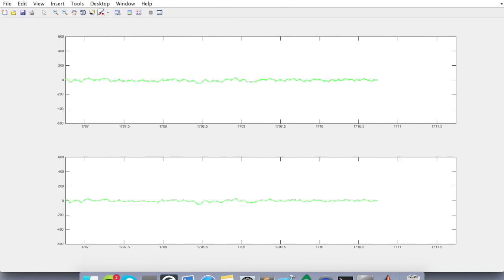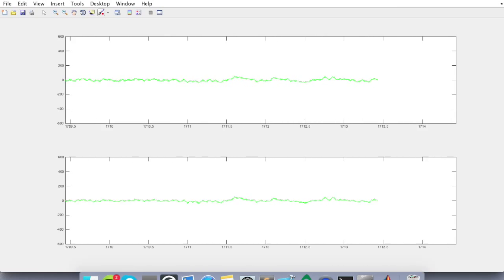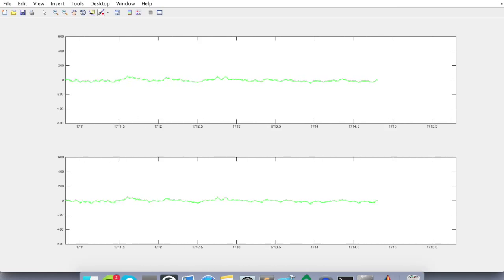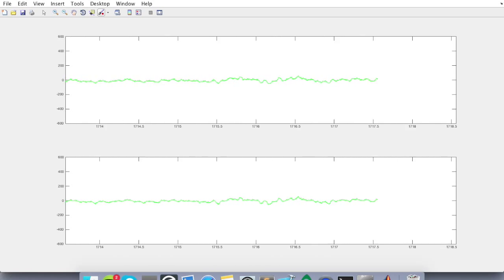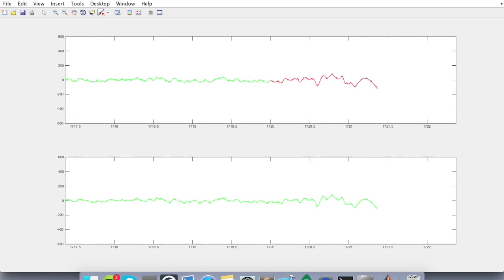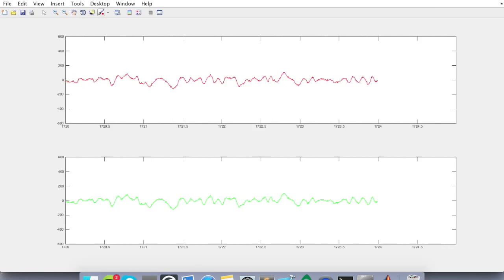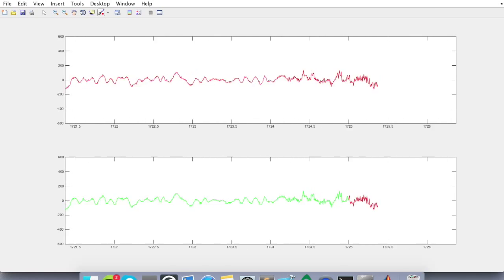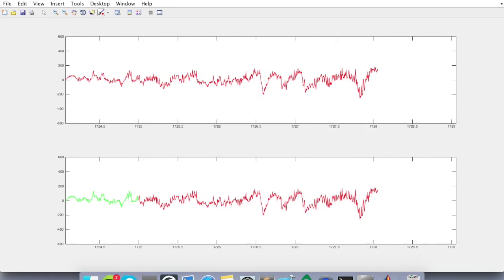Now the top plot shows the seizures as labelled by the dataset, and that plot will go red when a labelled seizure appears, and on the bottom it'll go red when a detected seizure appears. So as you can see, the top plot has just gone red. That means there is a seizure present. The lower plot hasn't gone red yet, and there we go. So it's just detected the seizure. It's about 5 seconds late. Doesn't really matter too much, because as long as we send about 20 minutes before, 5 seconds doesn't matter too much.